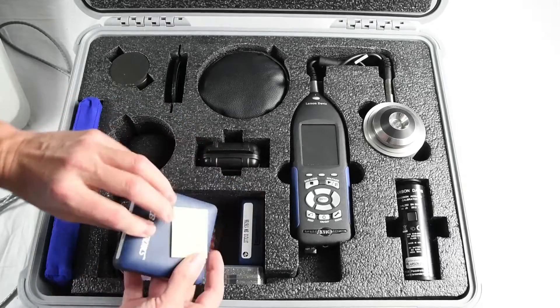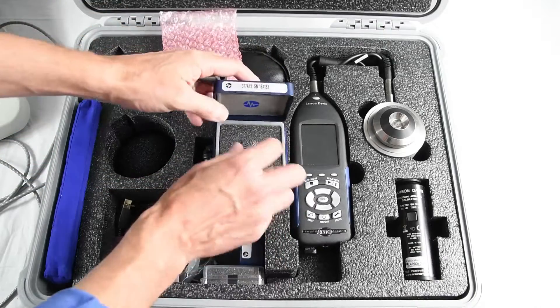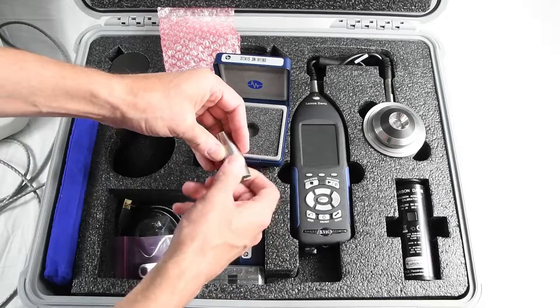For sound booth testing, the 377A15 1-inch pre-polarized pressure microphone can be installed on the preamplifier using the mic thread adapter.